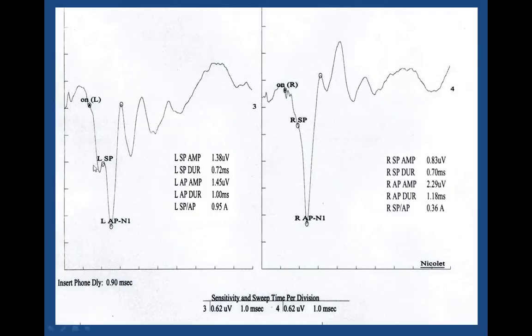The rationale for this finding has never really been totally explained or even totally accepted, but the simplest description is that the summating potential represents a distortion component of the transduction process. If hydrops, and the pressure associated with hydrops on the cochlear partition and the organ of Corti in particular, is present, then that will enhance the distortion aspect of the transduction process.